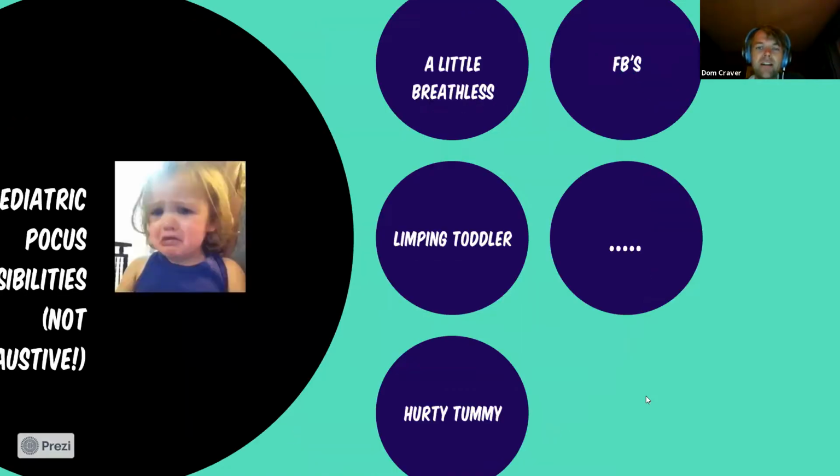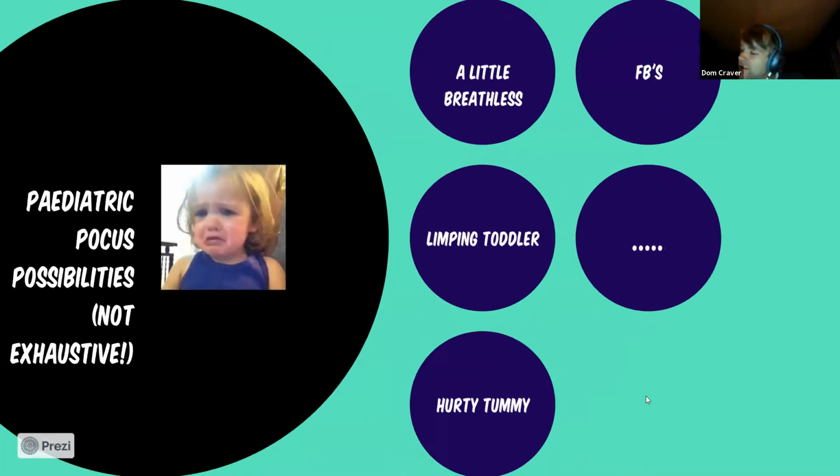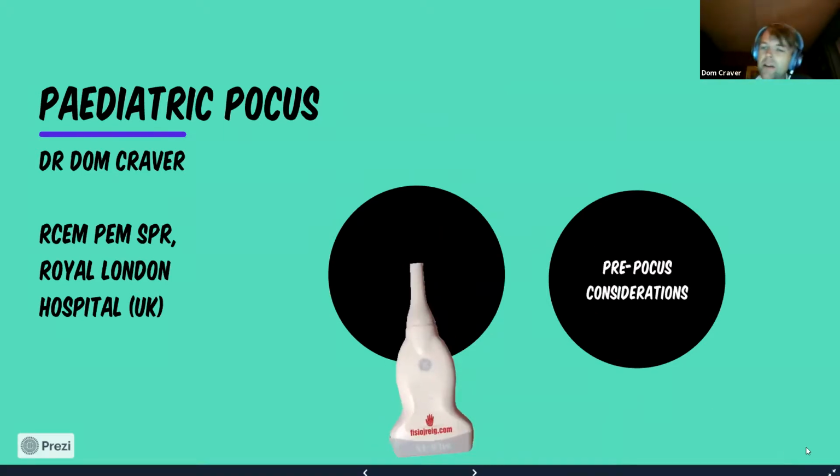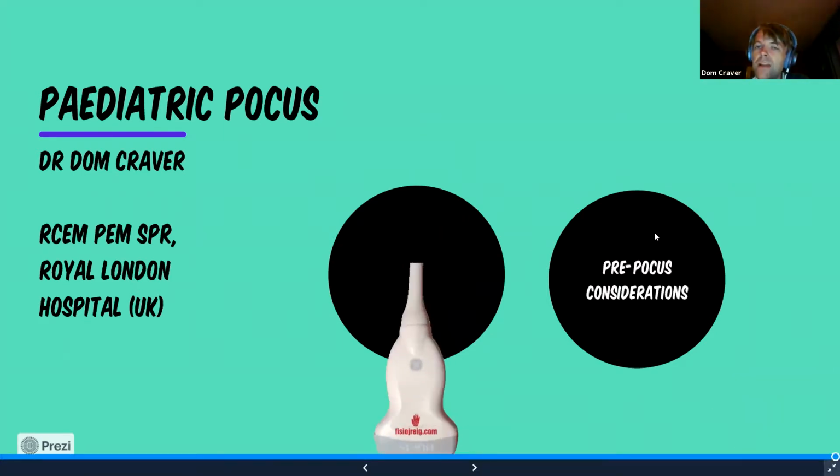So I didn't want to go too much. Finish a little bit early, but has anyone got any questions about utilities of PoCUS in kids?